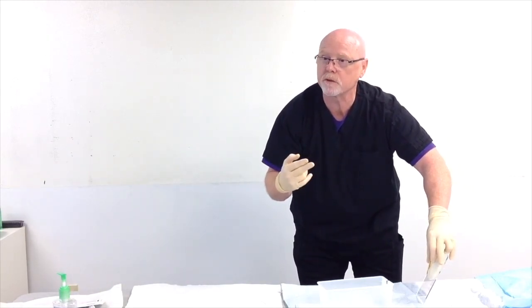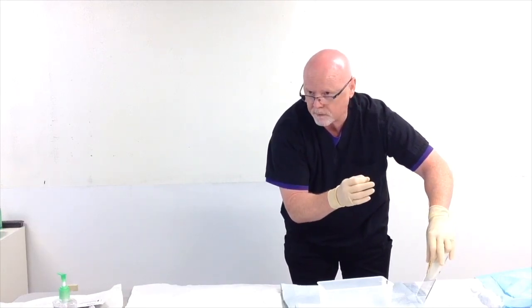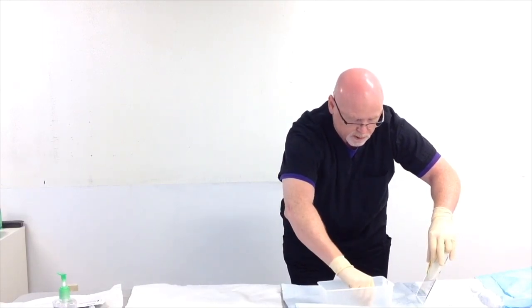So now I'm ready to go ahead and proceed forward with the cath. Your landmarks are going to be very good. They're going to be very obvious. You're going to have a big hole on the bottom and a smaller hole on top. You want to go to the smaller hole on top. That's the urethra. So you just reach in.